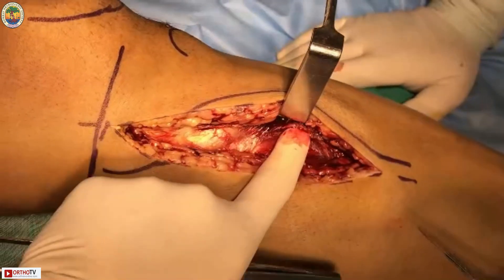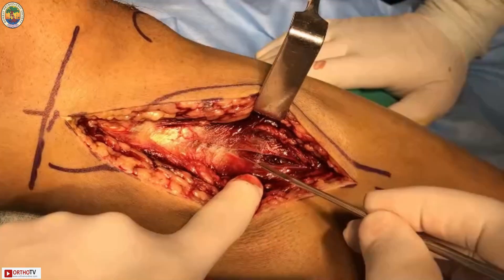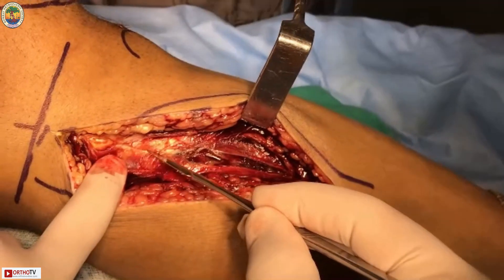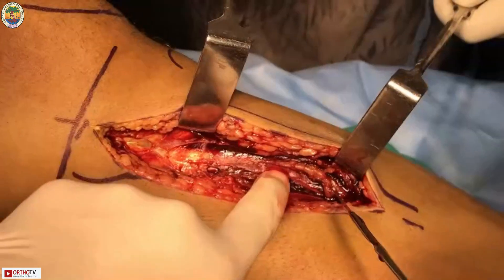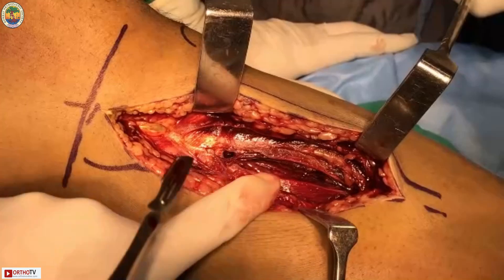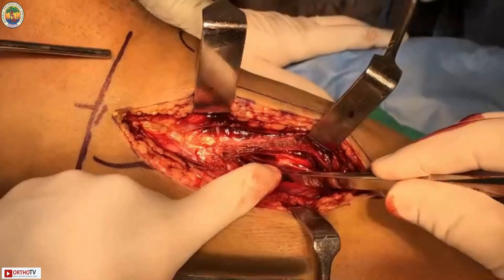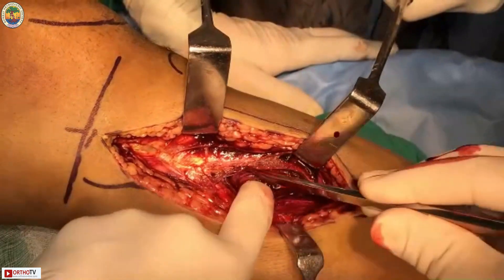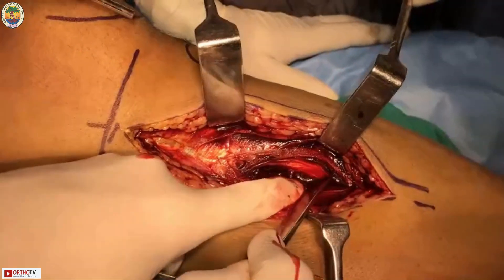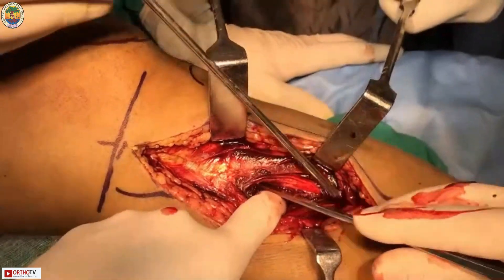The fascia over the posterior medial compartment is cut, exposing the medial gastrocnemius. A plane is made going exactly over the bone and the medial gastrocnemius is elevated, along with the soleus muscle attached here.